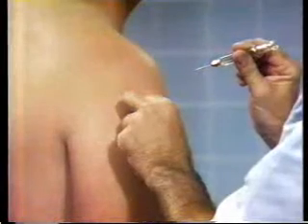Now that you know the most common sites, watch closely while the intramuscular injection is administered several times using different types of syringes and needles and the 3 sites we've discussed. First, using a reusable needle and syringe in the deltoid region. Remember the principles.